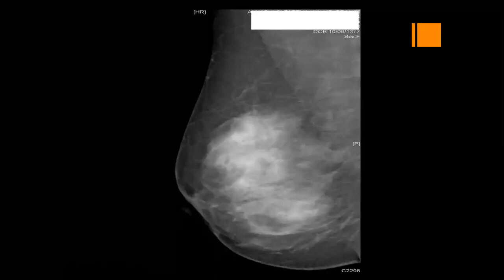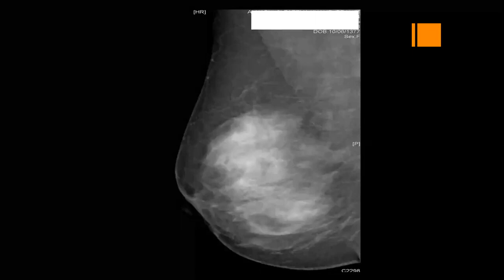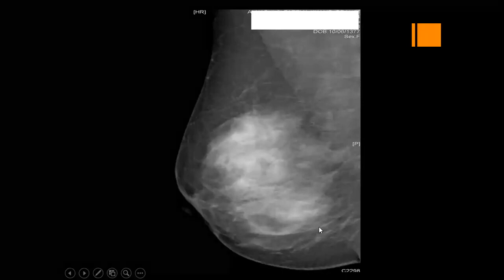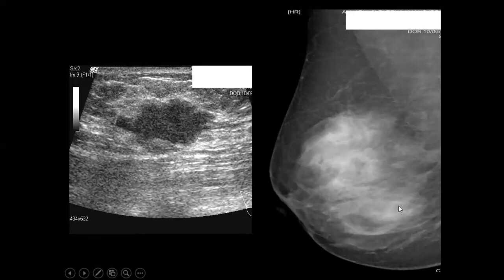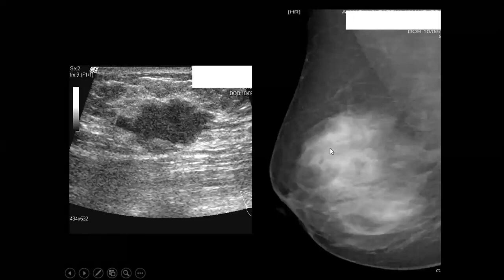I did not bring the other mammogram, the contralateral breast. But if it is the same in the contralateral breast, then yes, you might say this area is relatively denser than the remainder of the breast, but I might tell you this area is also denser. But you are right, at the same location, they have these lesions. Even retrospectively, could you explain? If I tell you this lesion is down, it's difficult. Even though it is heterogeneously dense, even retrospectively it is difficult to appreciate in this dense mammography. These are my cases.